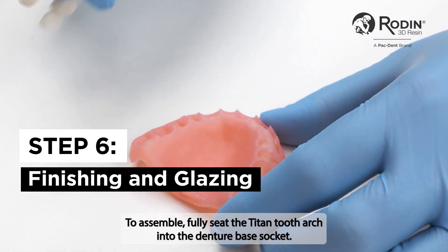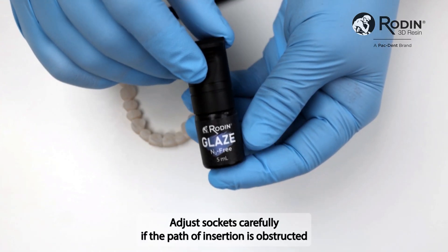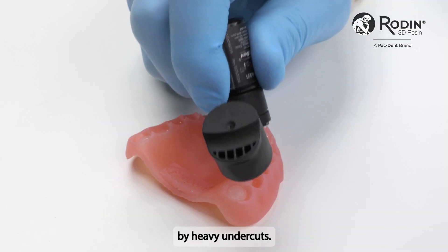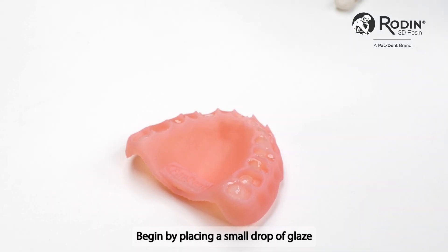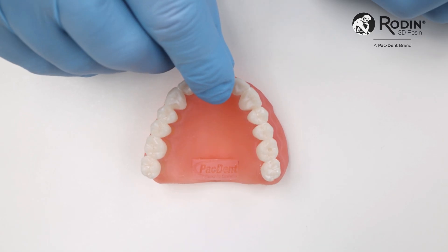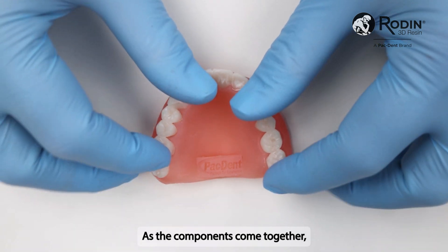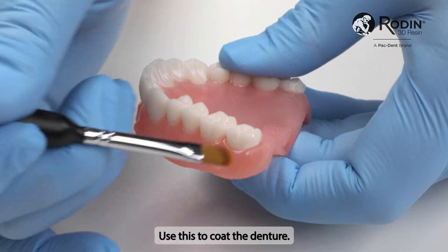To assemble, fully seat the tightened tooth arch into the denture base socket. Adjust sockets carefully if the path of insertion is obstructed by heavy undercuts. Begin by placing a small drop of glaze into each denture base socket before seating the tooth arch. As the components come together, excess glaze will naturally pool out from the interface — use this to coat the denture.